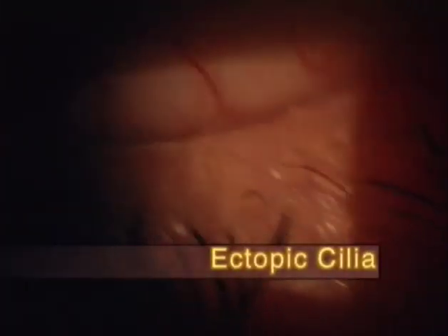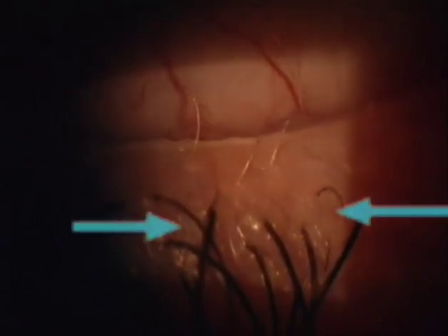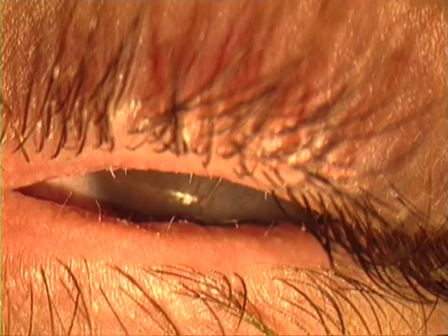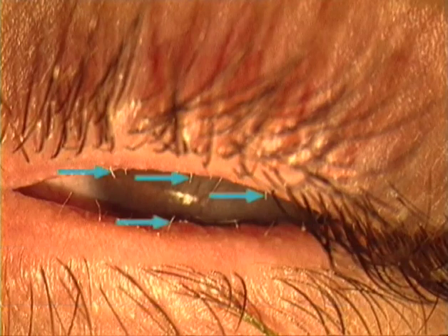Here we find just a few ectopic cilia, whereas the regular ciliary row has remained in its normal position. And in this case of ocular pemphigoid, we see a transformation of tarsal glands into cilia-bearing glands. The abnormal cilia emerge at the inner edge along a red strip of conjunctival tissue, while the normal lashes are in their normal position.